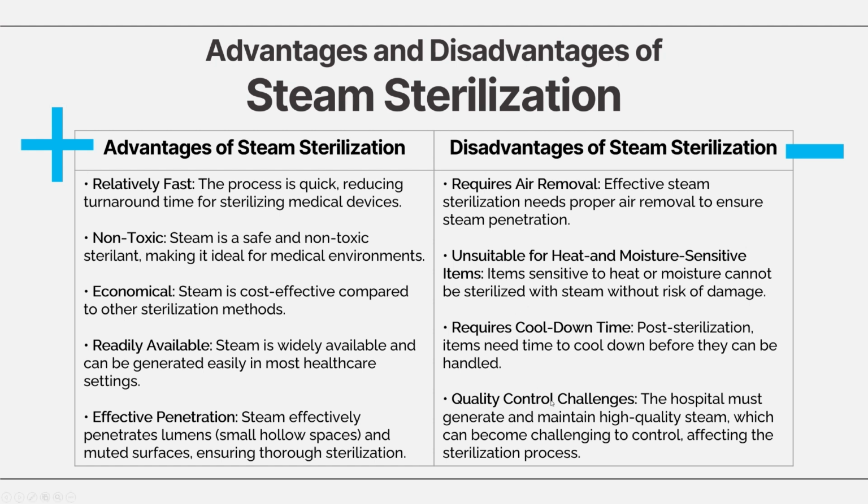And of course, there's quality control challenges. Maintaining consistent steam quality, correct dryness fraction, the pressure, temperature, it's vital. Fluctuations in steam supply, poor water quality, or equipment issues can compromise sterilization effectiveness.